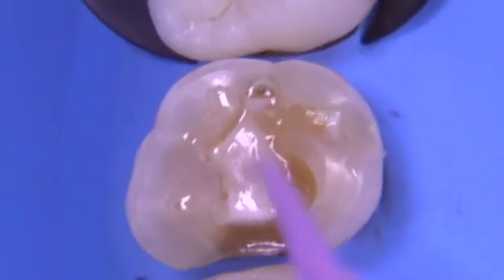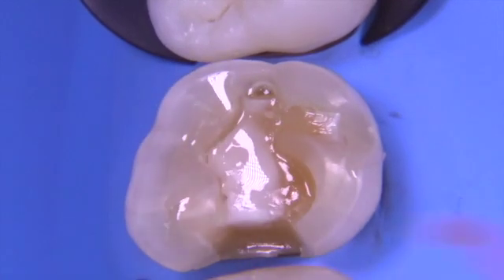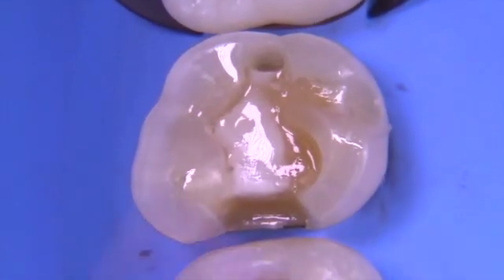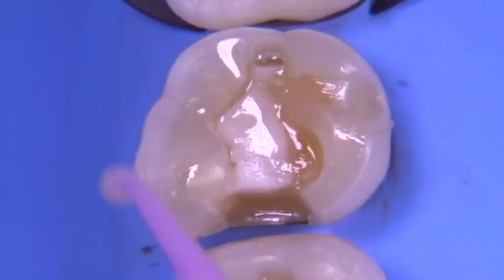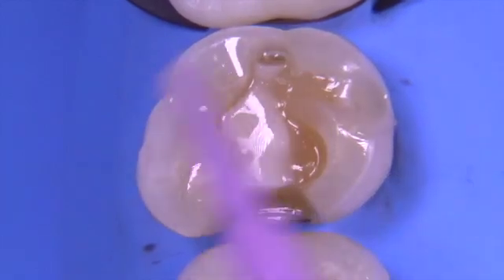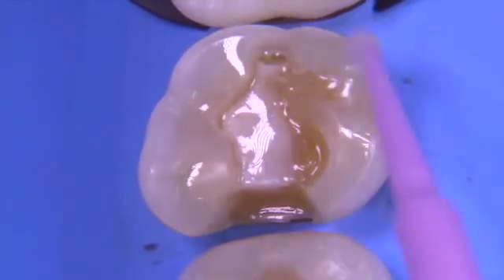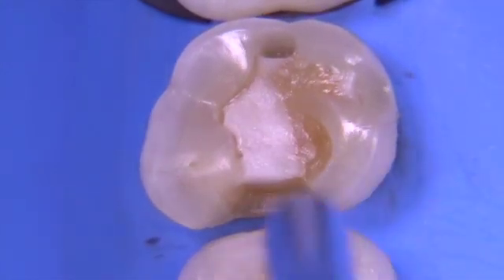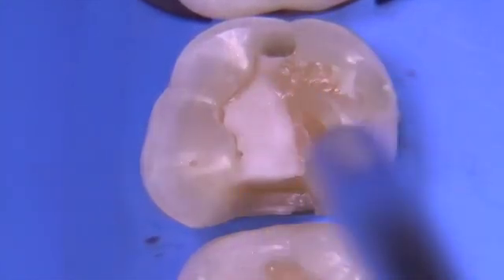After the rubber dam is placed and everything is cleaned up, we don't want to use air abrasion at all during this procedure because we want to keep the enamel margins completely unaltered. We're going to use several coats of Gluma — you can either blow it dry or rinse it off depending on your philosophy, but I think it's really helpful to place this before you cement.